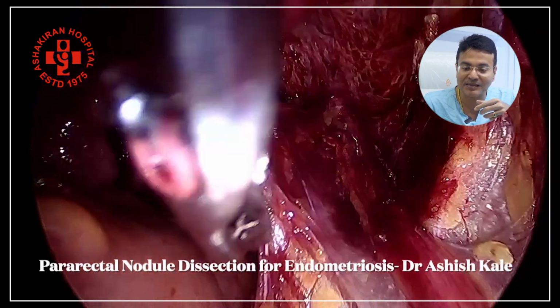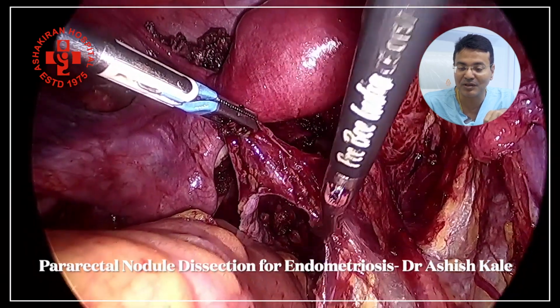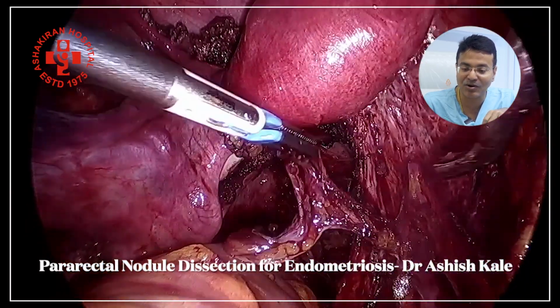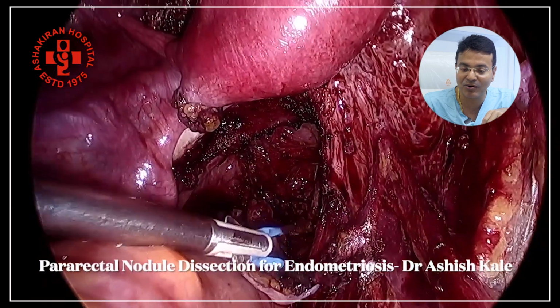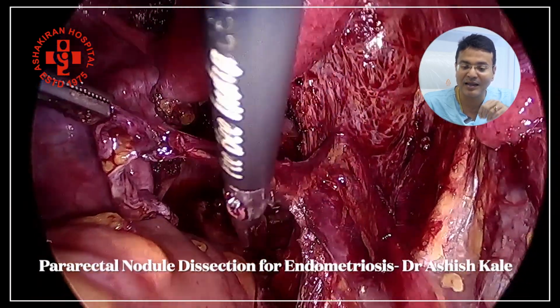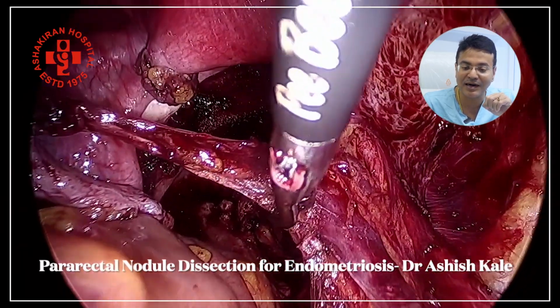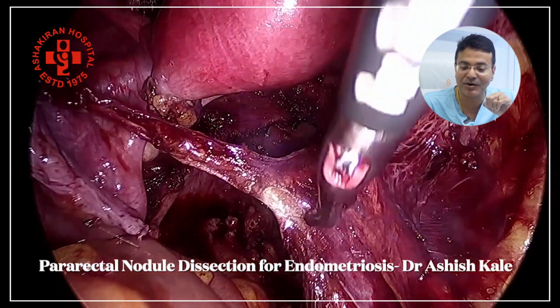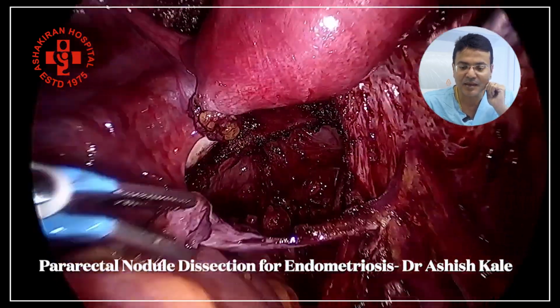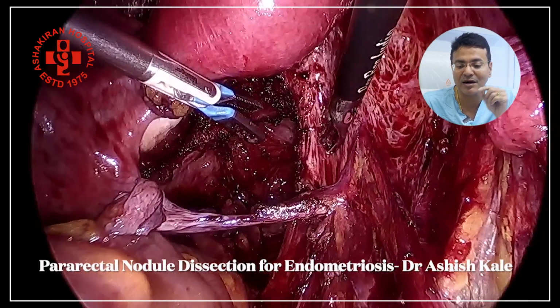You can see the plastering of the peritoneum and the parametrium to the tissue. The pararectal space is already dissected. You can see below the bipolar where the pararectal space is already dissected out, and in this patient there was adhesion at the rectum. So the rectal dissection is already done and we are going to dissect out the lateral spaces of the ureter. Herein, we are going to dissect a peritoneum which is already affected.